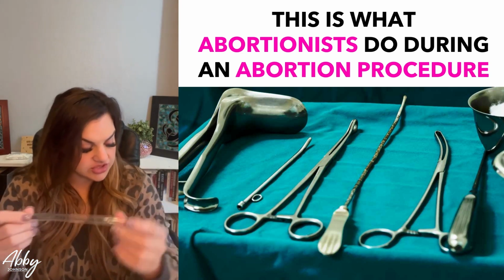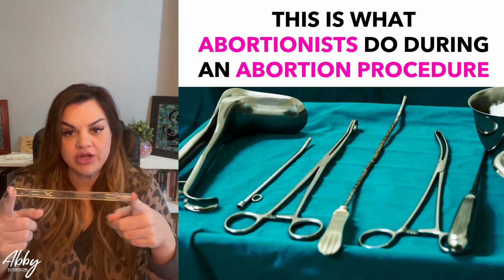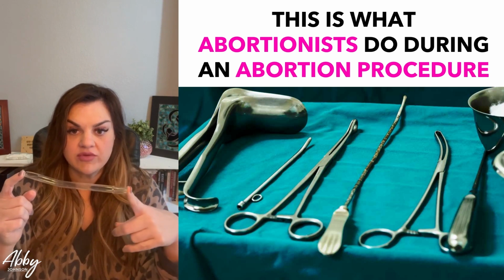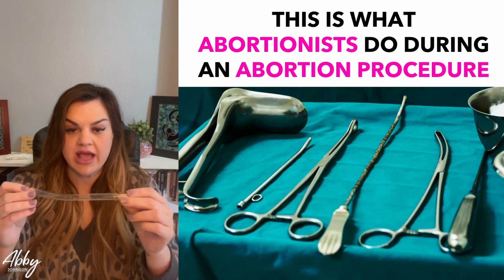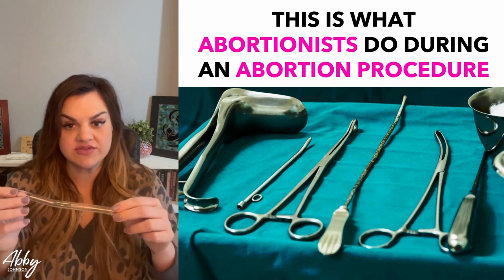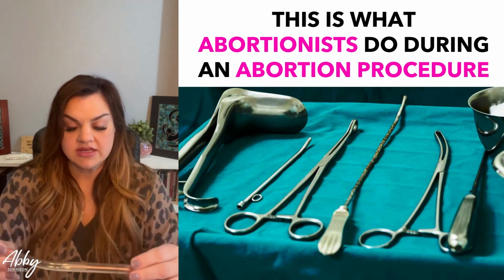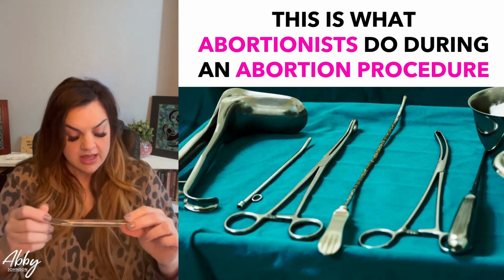This is actually a 12. This is a 12 millimeter curette. So this is what would be used for about a 12-week baby. They get bigger and smaller depending on how big the woman's pregnancy is, because it has to be big enough to suction the baby's head through it. That's the largest piece of the child. So this would be used for about a 12-week baby.